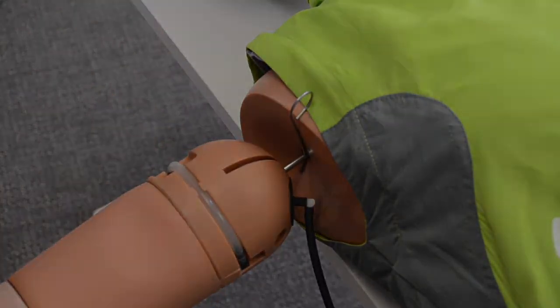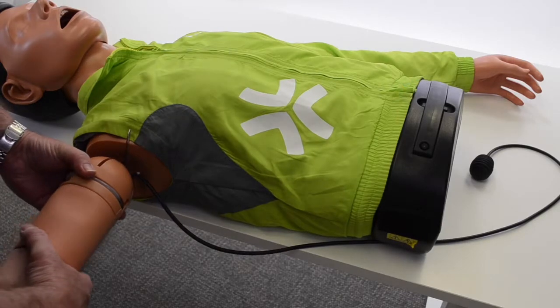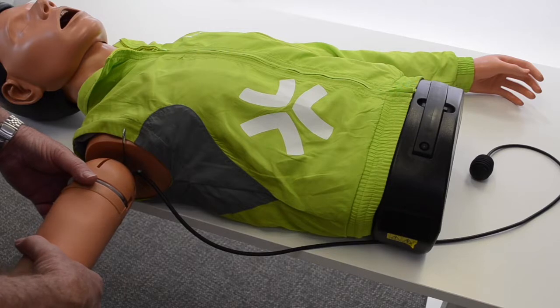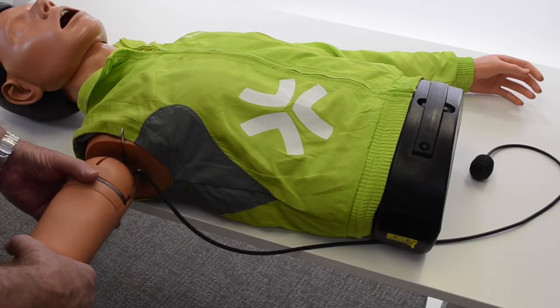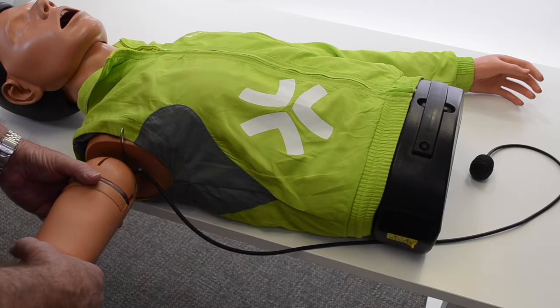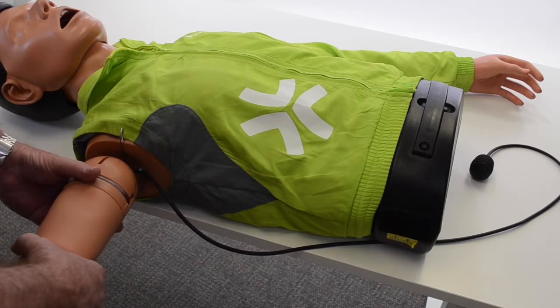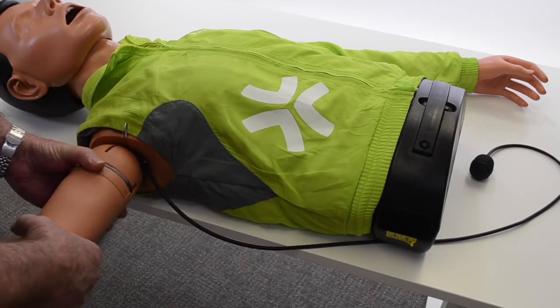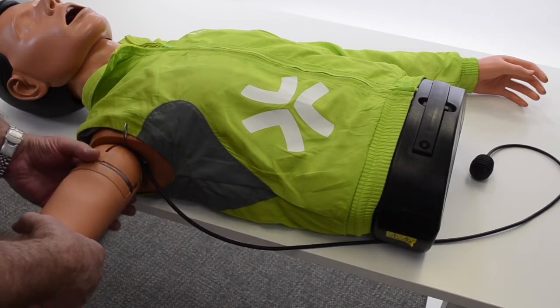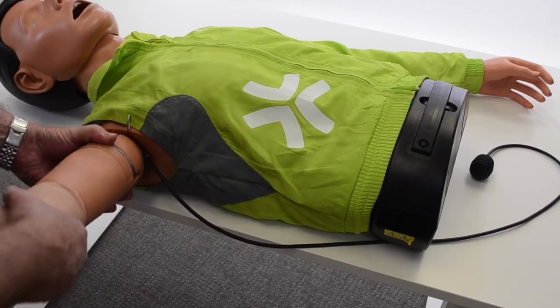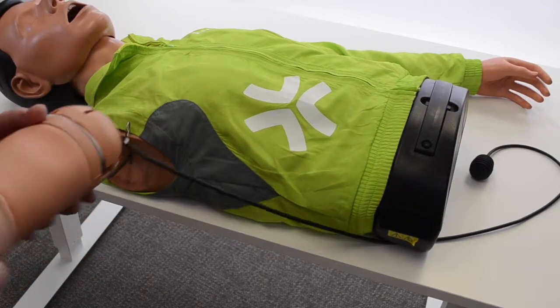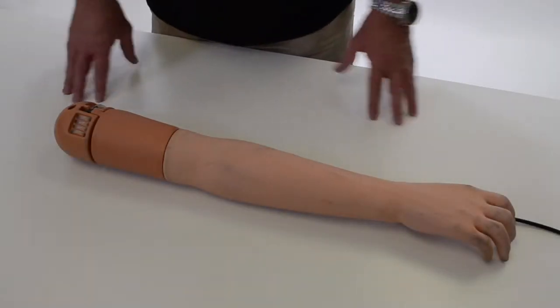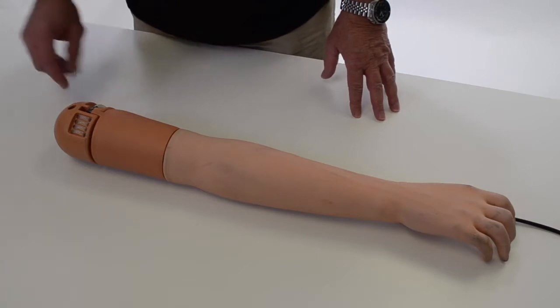Now the mannequin is hooked on by a loop. The easiest way to get to that loop, we're going to push in straight and that takes that loop off of the horizontal pin. Then we're going to lift straight up and the mannequin comes off.